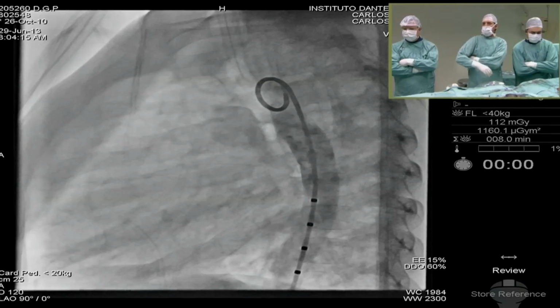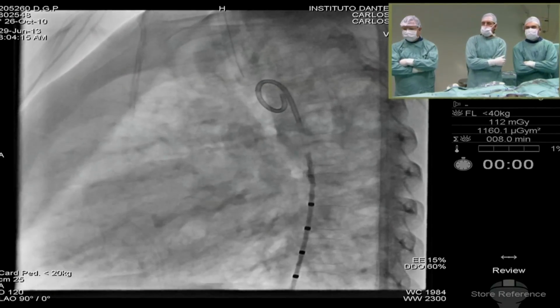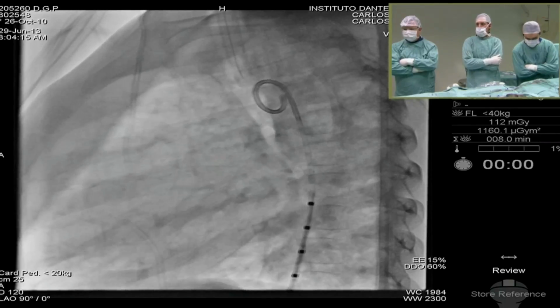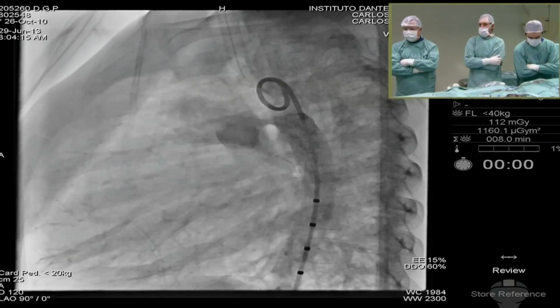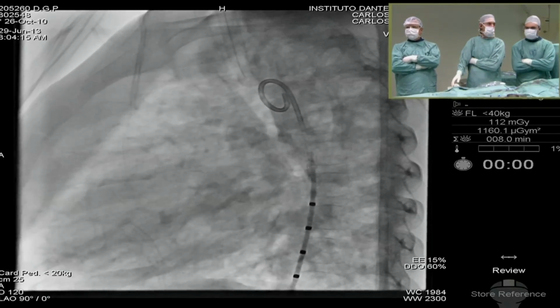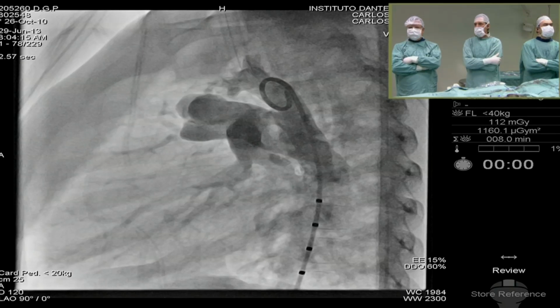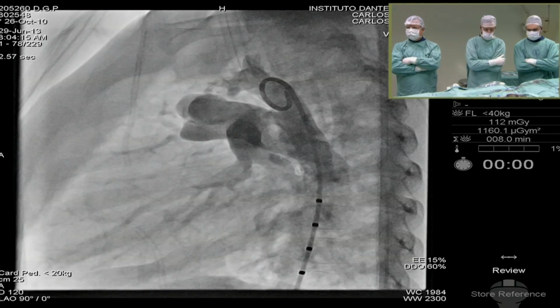Okay. If you see the pictures, I think it's on the screen right now. Carlos, can I just ask the audience about the duct here? I'm just going to ask the audience here some questions about this duct and devices. So Zahid, first of all, I was wondering, initially he said the gradient is 55 across this tubular ductus. That was in the other lab, apparently. No, the other lab, the echo. Oh, on echo, sorry. Yeah.